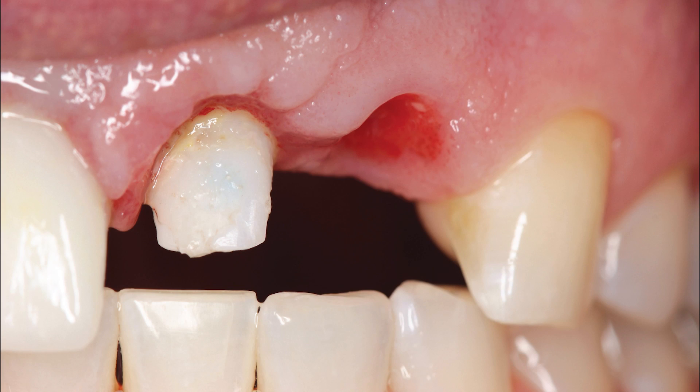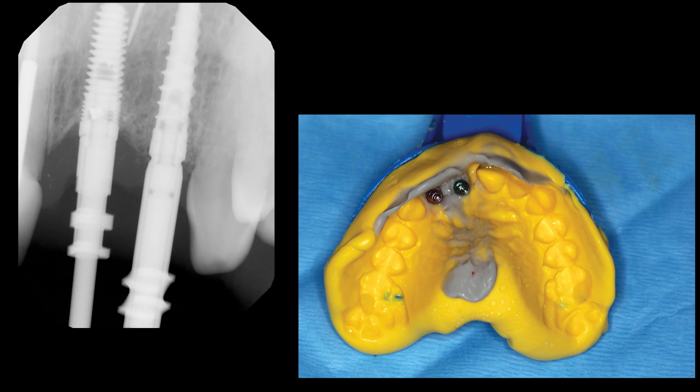After the healing period, nicely formed soft tissue contours were revealed in the interdental papilla. An open tray final impression was taken with medium and heavy body vinyl polysiloxane materials. After placing open tray impression copings, the complete seating of which was verified radiographically. As shown at the lateral incisor site, the conical connection of the Hahn tapered implant allows for excellent seal, stability, and strength.